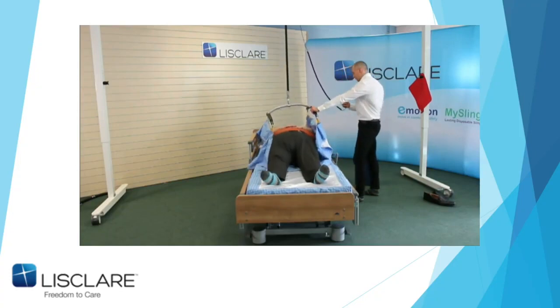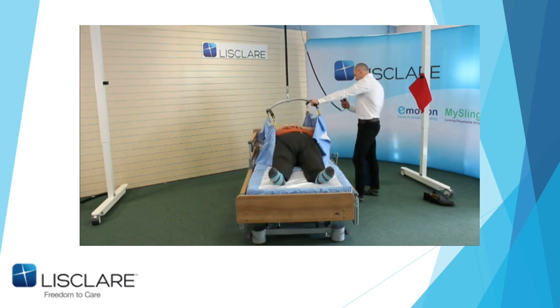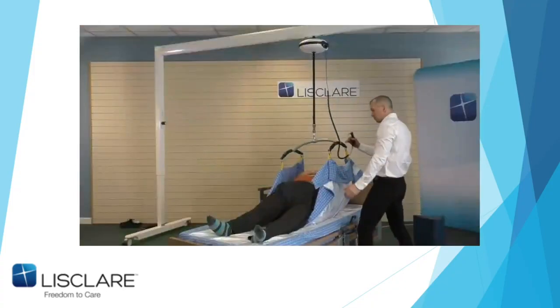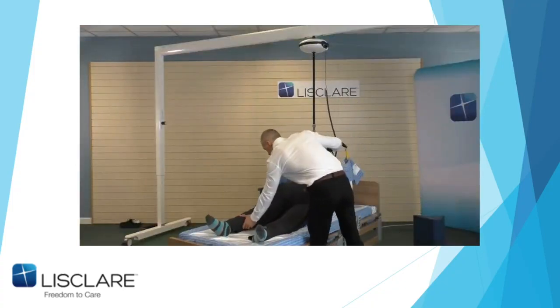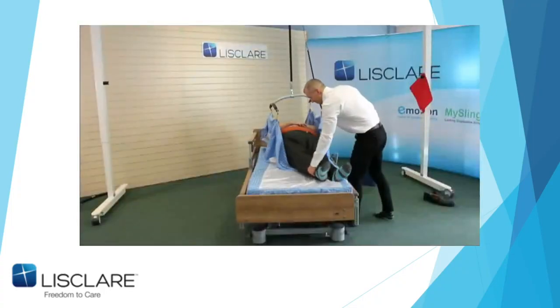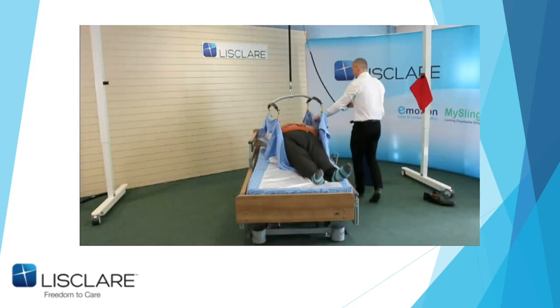Because all he needs to achieve here is just take my weight. That's you, John. Take it up a wee bit more. That's enough. He needs to move my legs across first, just gently, one at a time. All the way, John. That way. Towards it. Turn me on the right. There you go. And then basically lift me up a wee bit more.